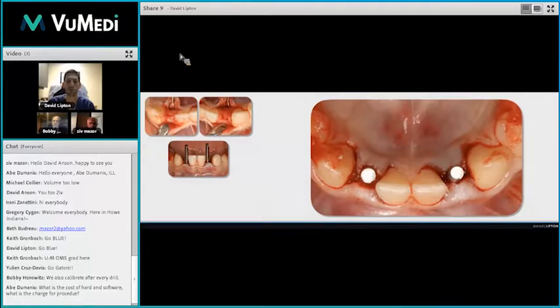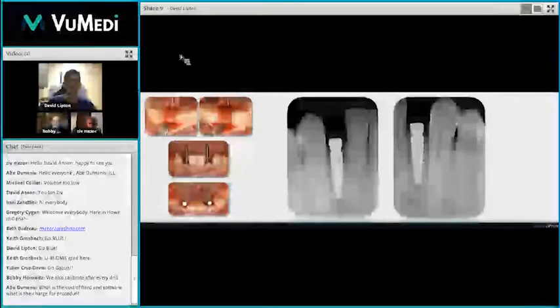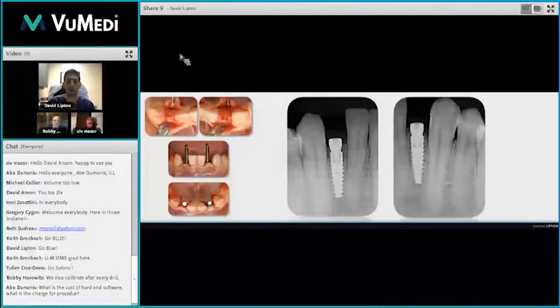And when you actually look at the radiographs, I'm not confident we could have done this freehanded, and even with the static guide, knowing our literature, if we were off 1 millimeter, we were buying ourselves an extraction and another implant adjacent to that. So dynamic navigation thoroughly worked for accuracy and precision in this case.